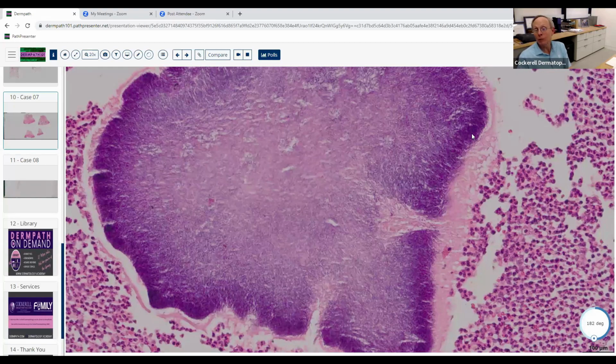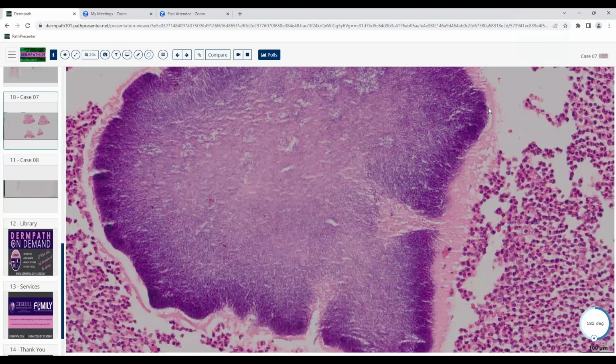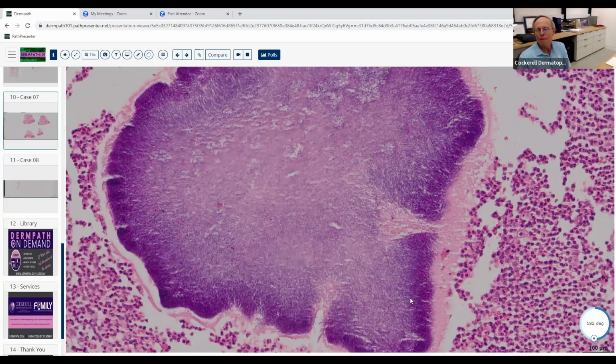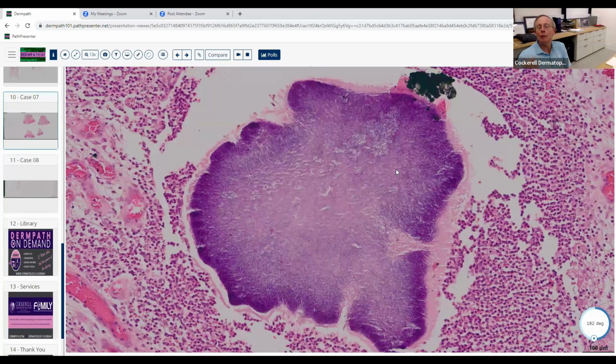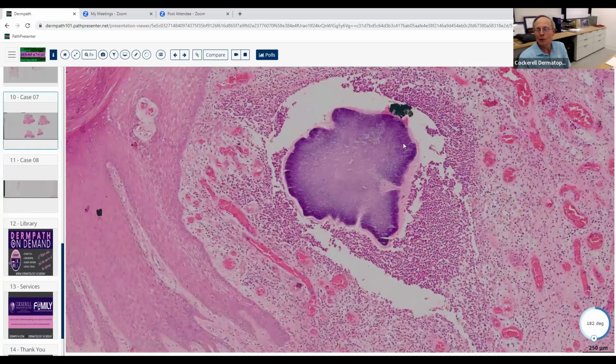We've already said it's not botryomycosis because they're not gram-positive cocci. They look like little filaments here. We look at the periphery. We don't have oil immersion to really look at it, but they look almost like a star, if you will. So which one do we favor here? It's also lots of gram-positive purplish color. Almost does look like calcium. Probably actinomycosis. Good, excellent. So this is actinomycosis. Beautiful example of that.